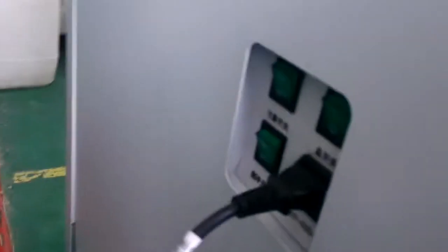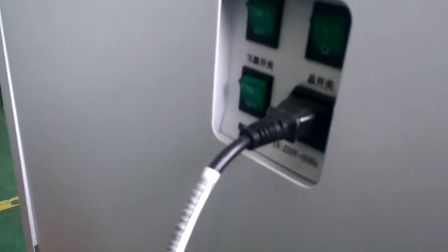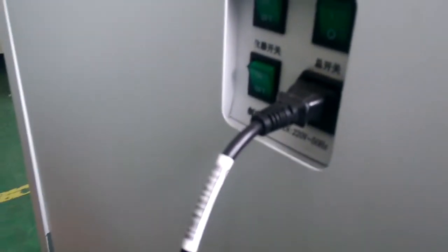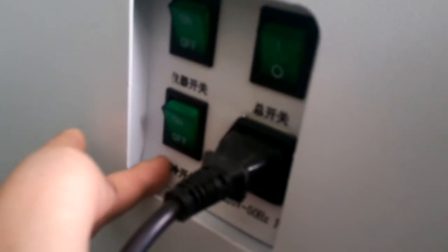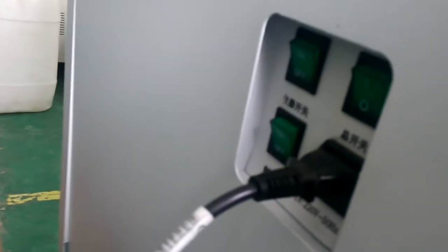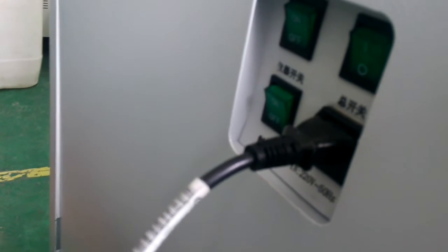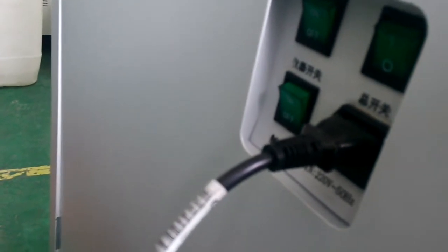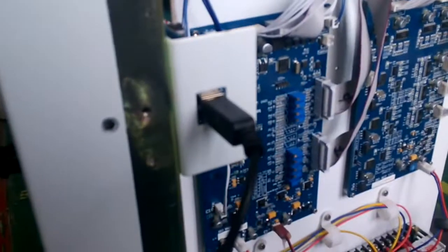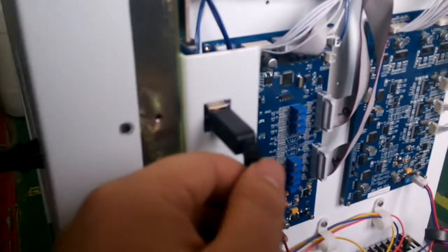We found this is a power switch. This is the main power. This is for the instrument. And this is for the refrigeration. And this is a power supply. The machine we sent to you is 110 volt. This is USB information transfer, connect to the computer.